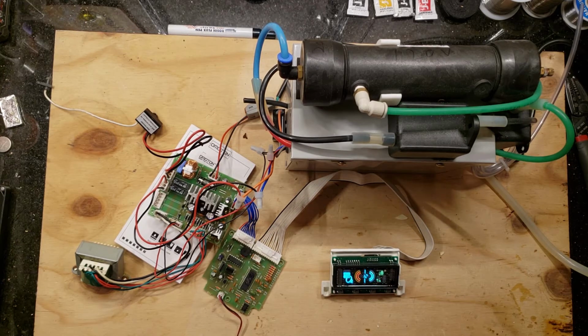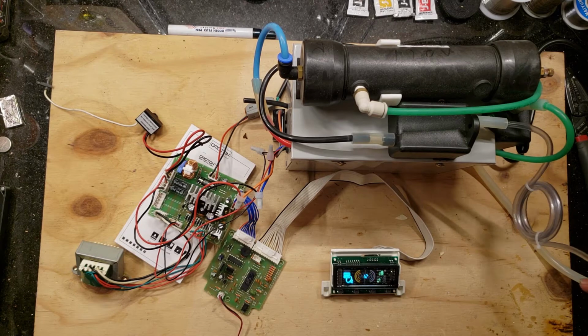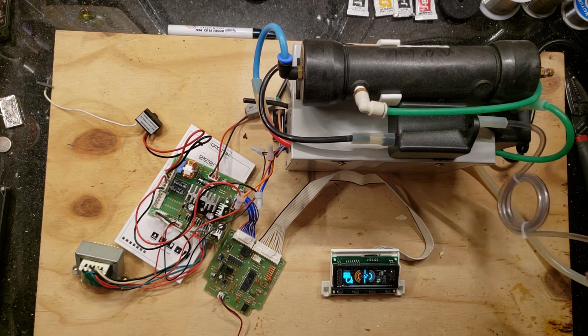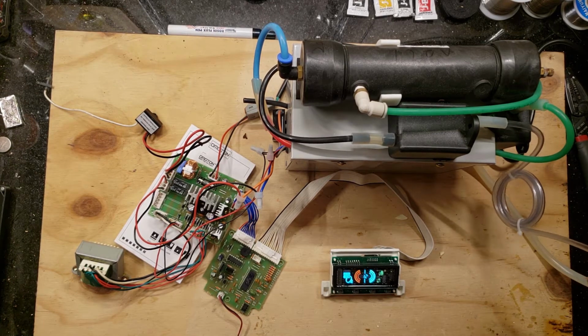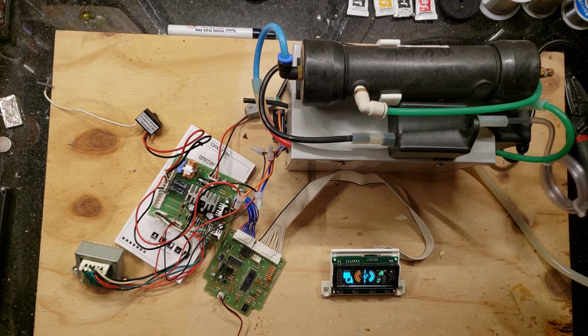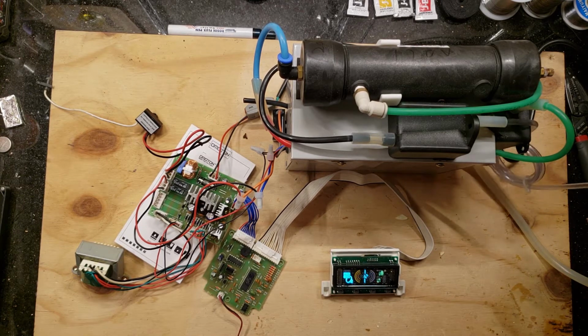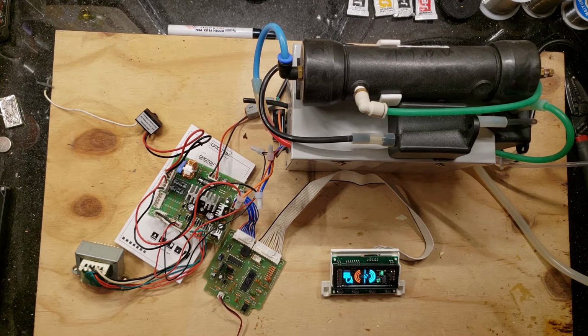Now, is it doing anything for your health? I don't know. But it does seem to produce 30% oxygen on its output. And I guess that's the input right here. So I guess, since this was inside the case, the ion thing does produce ions that don't get sucked into this, but I don't know if it does anything different.